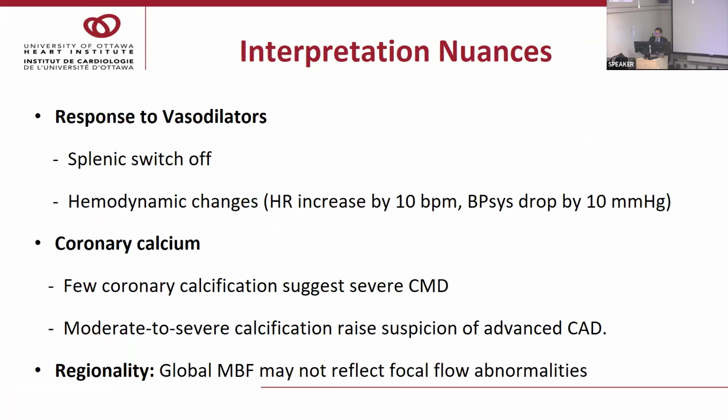A few words about interpretation nuances. When interpreting flow parameters, it's always important to make sure that the patient had an adequate response to vasodilator stress. Splenic switch off is useful to evaluate this response. Hemodynamic changes during stress are also helpful, but I would say heart rate and blood pressure changes are sometimes inaccurate.